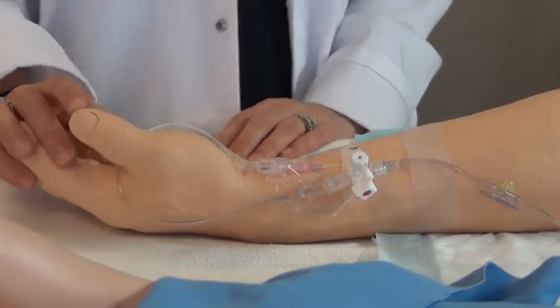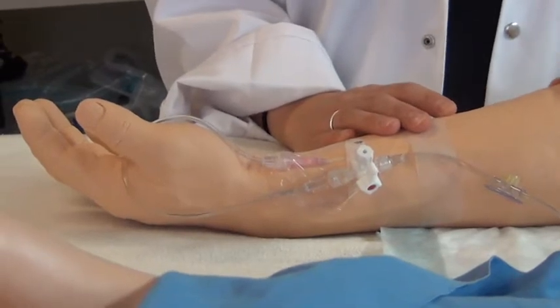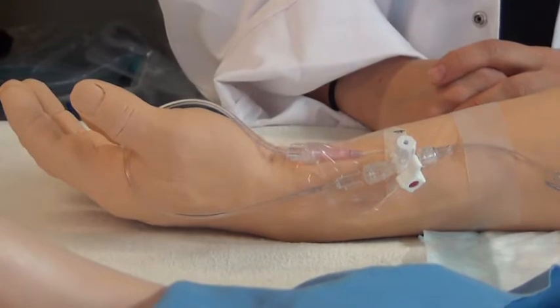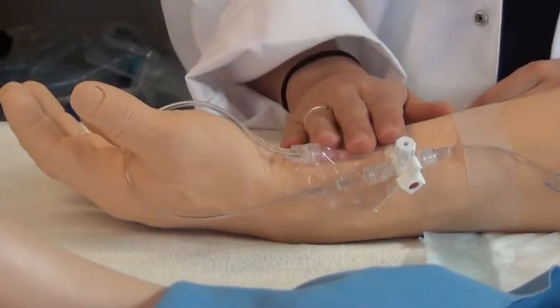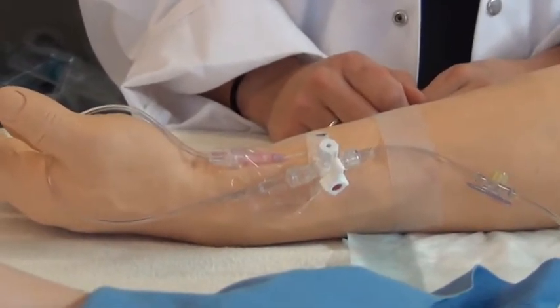In this section, we'll be talking about arterial lines. Now remember, arterial lines are catheters that go into an artery. There are different locations that may be chosen by the physician for an arterial line, like for example, the radial artery, like in this case, a brachial artery or a femoral artery.